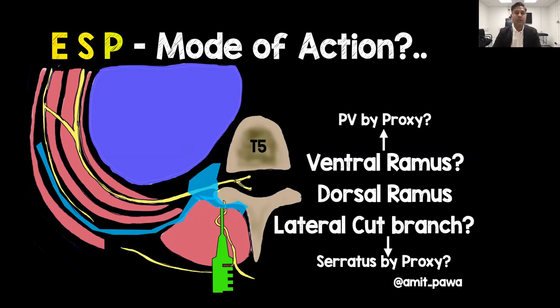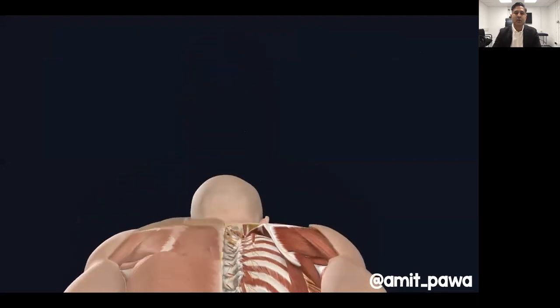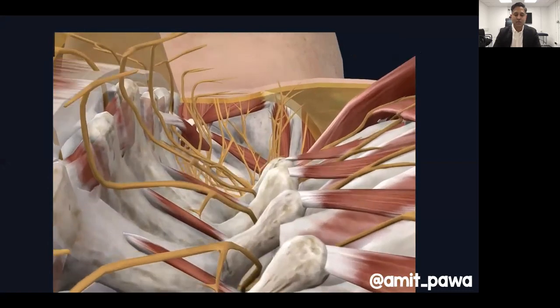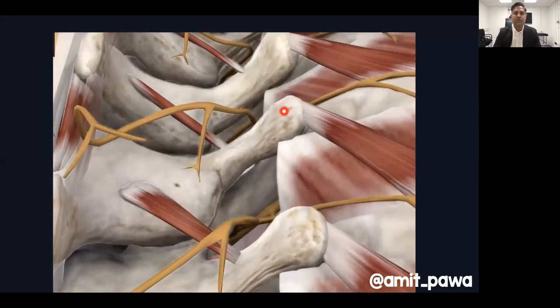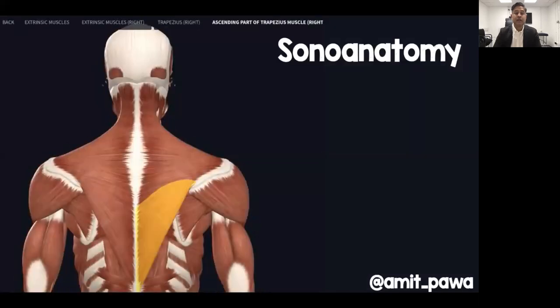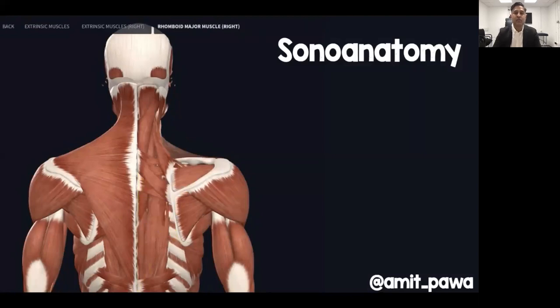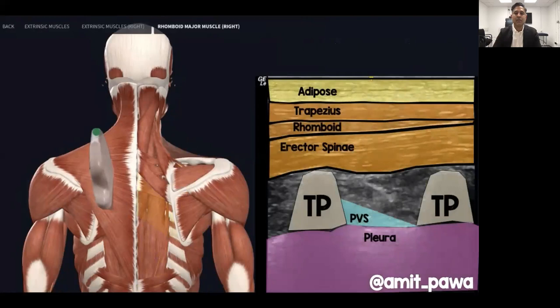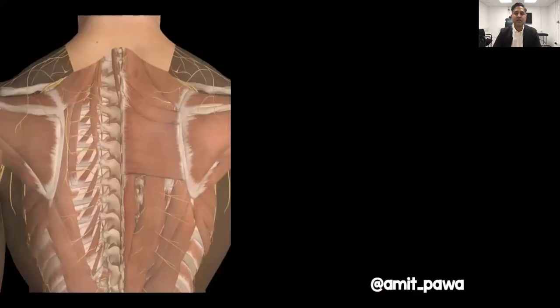Cadaveric studies are somewhat conflicting, but what we know is that it's effective. From a local anaesthetic's-eye view at the transverse process, you can see the dorsal ramus, the transverse process, and a potential window into the paravertebral space. For sonoanatomy, once we take away skin, trapezius and rhomboids, we highlight the erector spinae muscles. Placing a linear probe in a paramedian orientation on the back generates an ultrasound image with a tombstone-like appearance of transverse processes, pleura, paravertebral space and the muscles above.